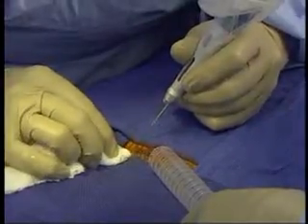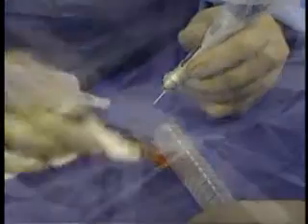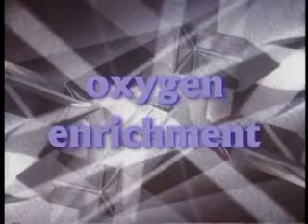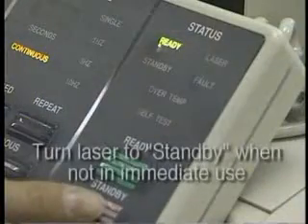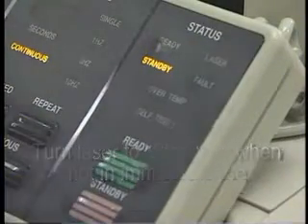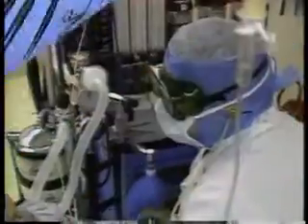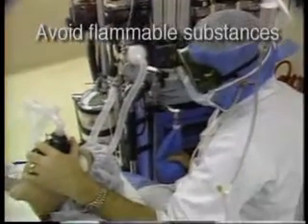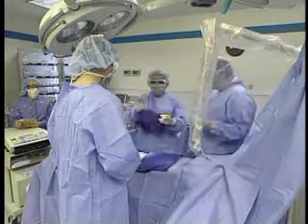Turn the laser to standby when not in immediate use. Use instruments with surfaces that reduce specular reflection. Avoid flammable anesthetics, prep solutions, drying agents, or ointments, and decrease oxygen concentration. Have a basin of sterile water or saline available on the field. Use flame retardant drapes or moistened reusable fabrics around the areas that are close to the laser treatment site. Never place hot fiber optic devices on surgical drapes or dry towels. Keep fire extinguishers immediately available when lasers are used.